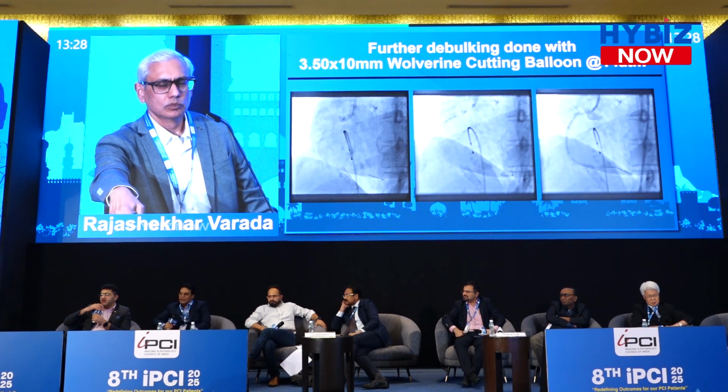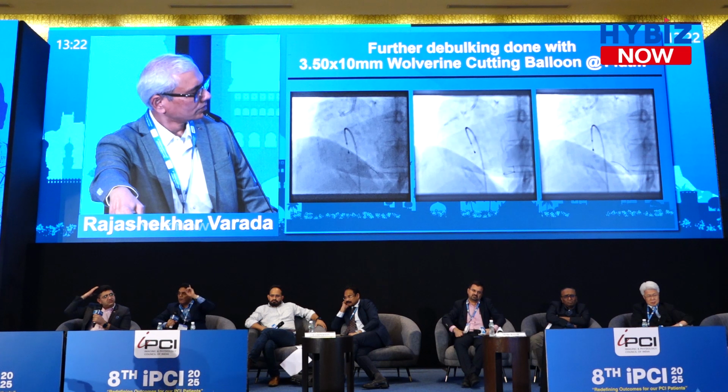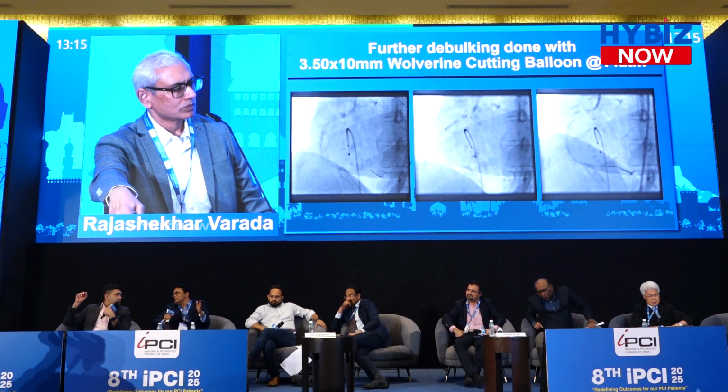Now, NC balloon at high pressure can be used. After that, there is a luminal gain. Once after rota, NC balloon dilatation could have been done. It's a mandatory step.